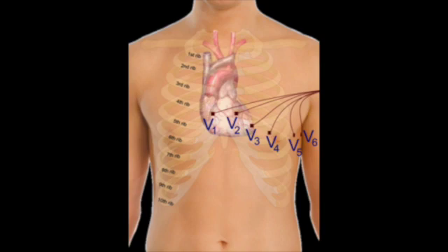Yeah, and they detect the electricity as it comes towards it, right at that spot of the heart. Exactly. That's why it's looking at it from all different views. Think of these as little cameras, and they're all looking at the heart from different views. So V1 is literally the electrical activity at that spot, taking a little snapshot. Oh, snapshot.